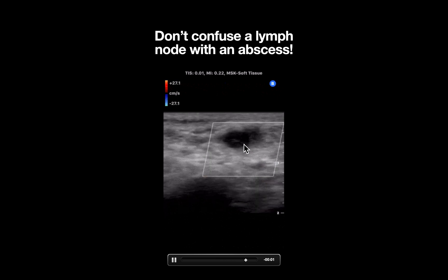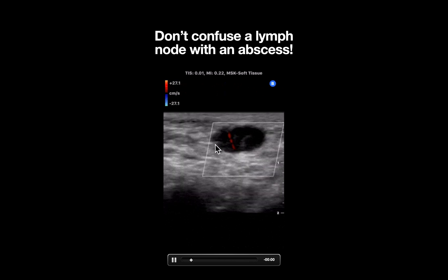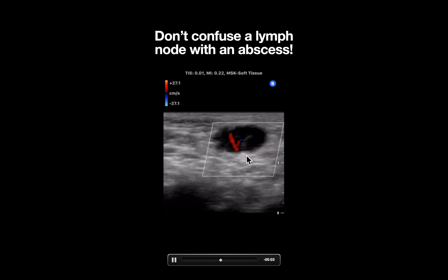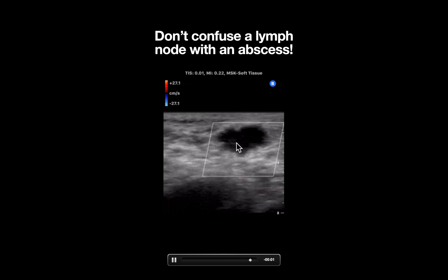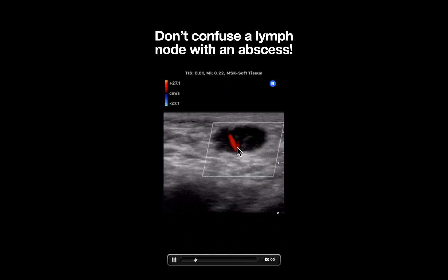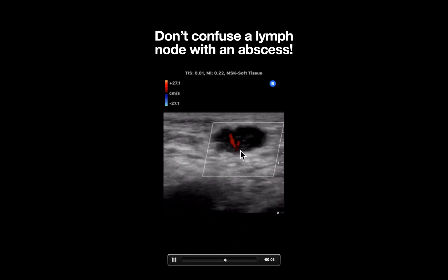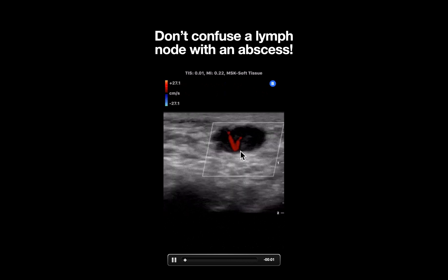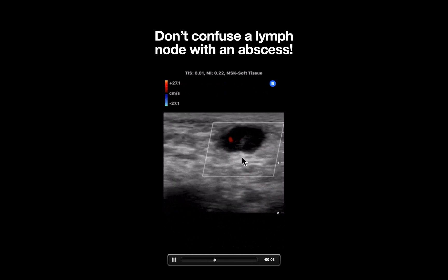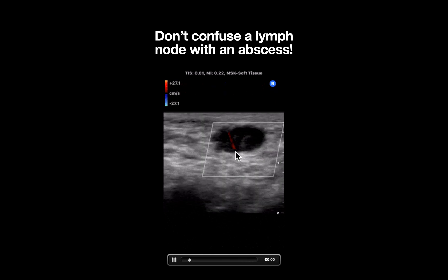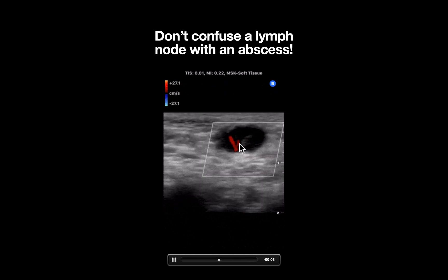Just below that, what we see is a well-circumscribed, nearly anechoic structure with internal echoes emanating from a central hilum, consistent with a lymph node. You can also see that color Doppler is being applied and pulsatile flow can be appreciated within the lymph node.